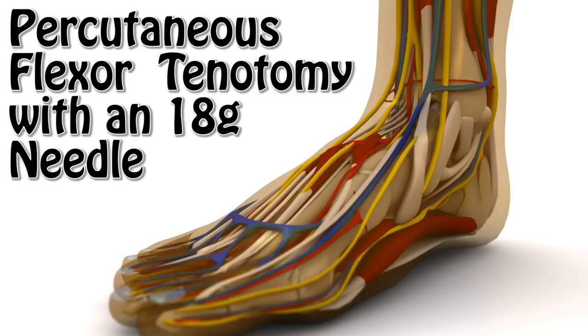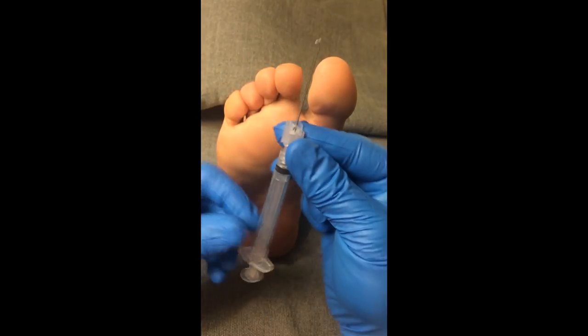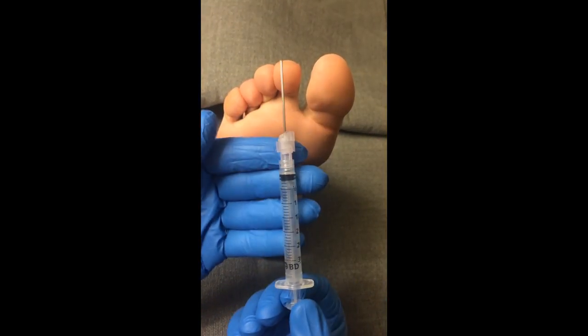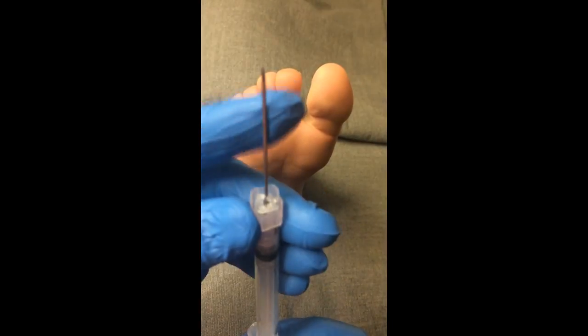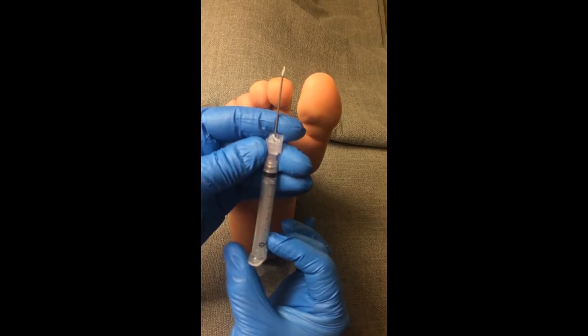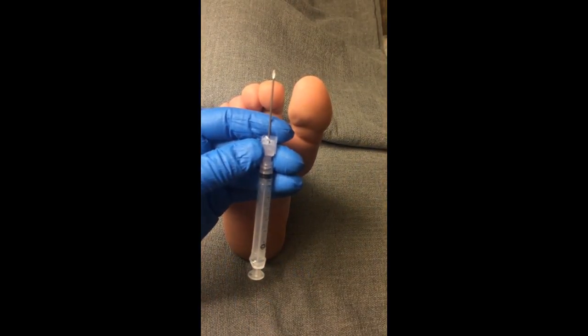A flexor tenotomy is a useful procedure in patients with contracted digits of the foot. In this technique, we demonstrate the use of a beveled 18-gauge hypodermic needle attached to a 3cc syringe as a surgical instrument to perform this procedure. Sterile protocol can be executed in the operating theater as well as in clinic scenarios.